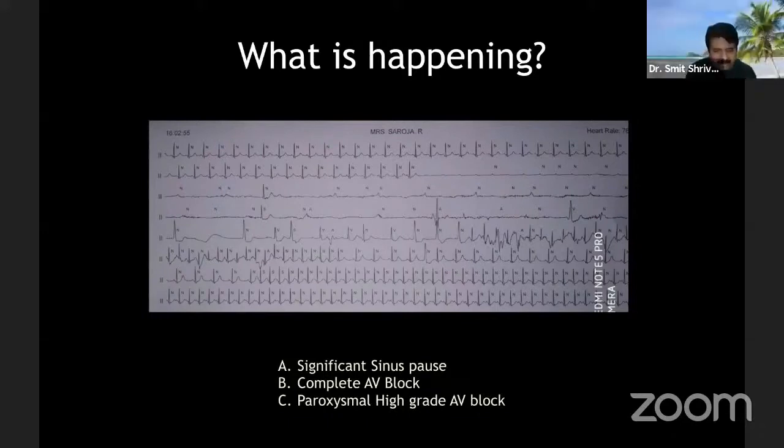Definitely a very interesting case. Yes, sir. In fact, this pause was almost 26 seconds in the Holter. We just called the Holter report. We ran back to her. Paroxysmal high-grade AV block. Okay. I think so most of them are absolutely right.